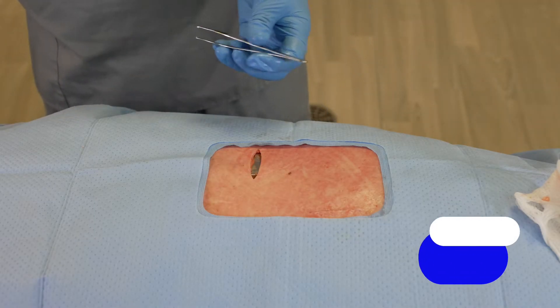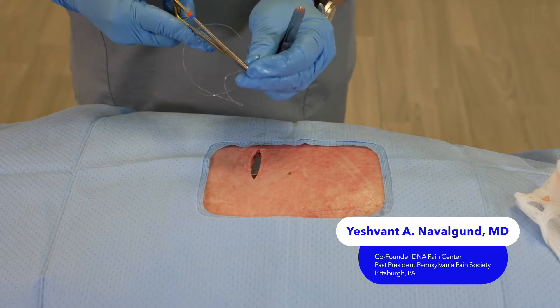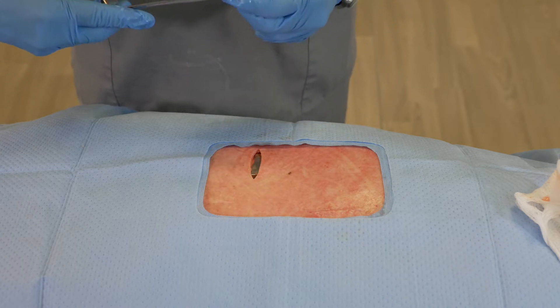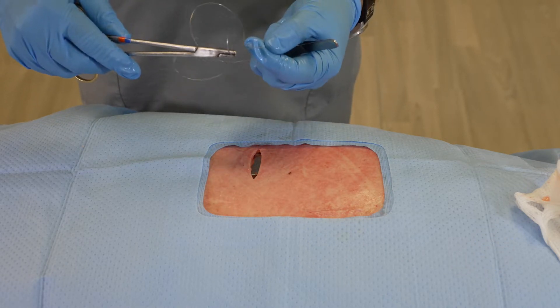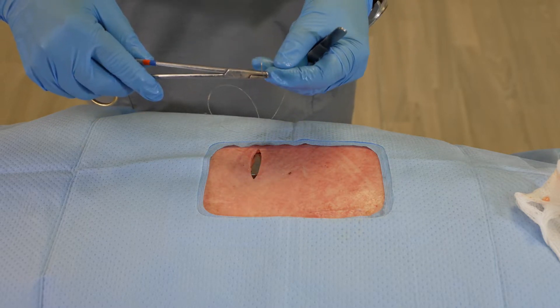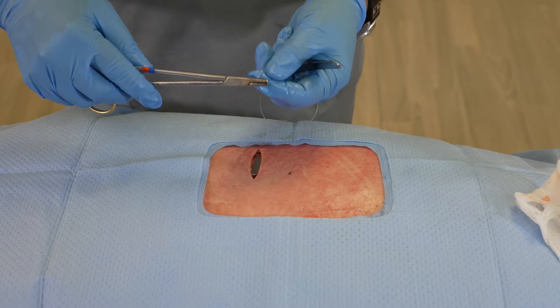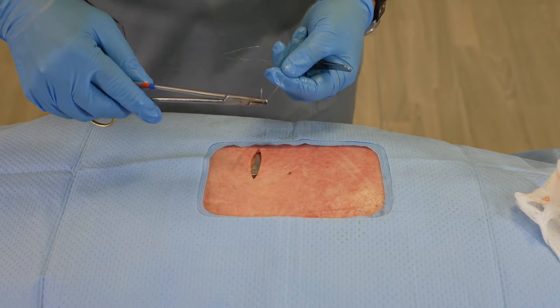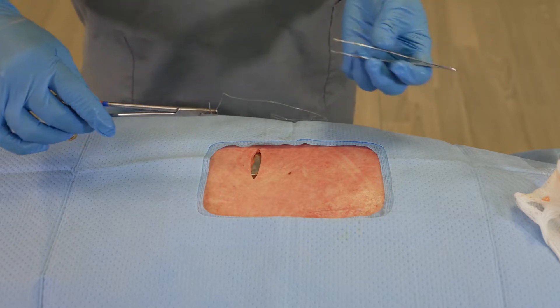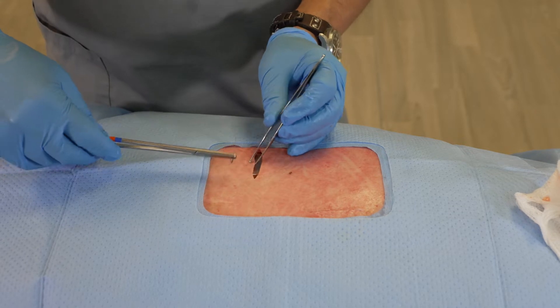I'm going to demonstrate how we're going to make this closure using the V-Lock Suture. The V-Lock Suture has a barbed texture with thousands of small barbs within the suture itself. That helps keep the suture running in a single direction and prevent dehiscence.